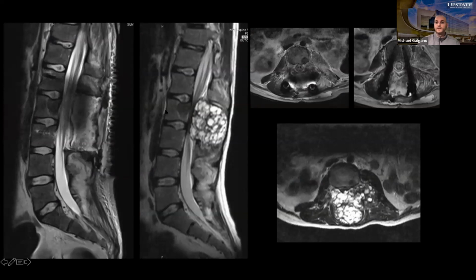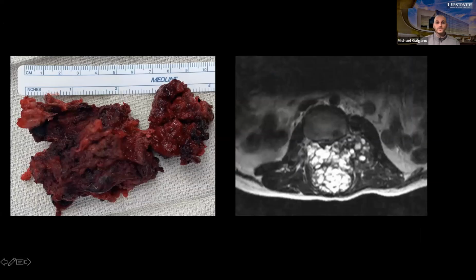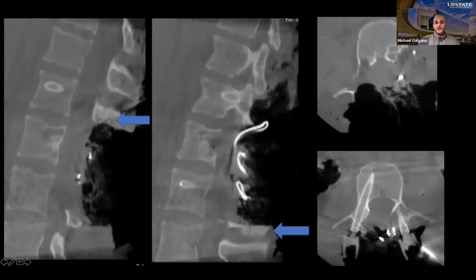And you can see we had a pretty nice GTR here. Here's a tumor. It was massive. It was almost about 10 centimeters in maximum width here. And I think it's important to keep in mind too that we preserved that top SP and that bottom SP like we did here. Because if you take this out, in my anecdotal opinion, you can accelerate the degenerative disease at the adjacent segments of the UIV and LIV +1.